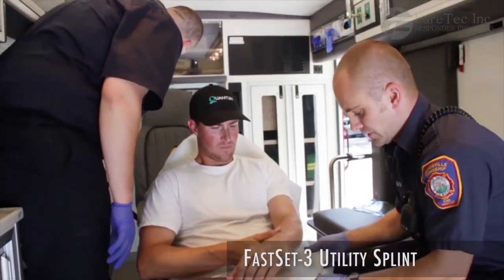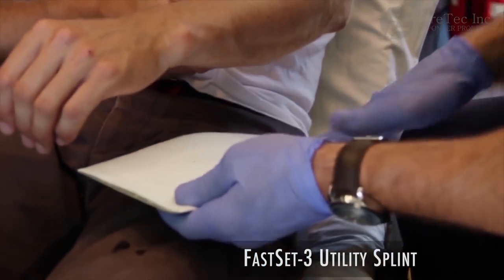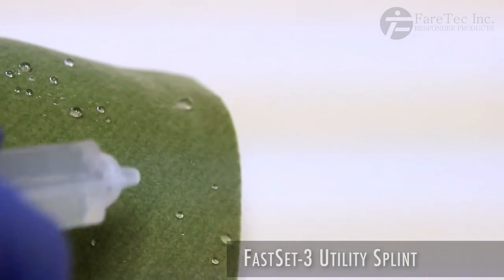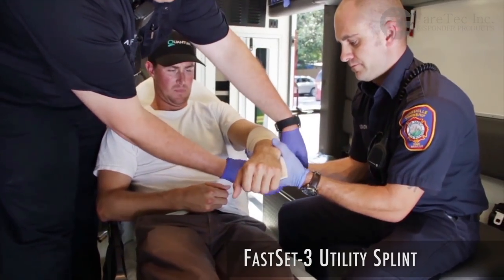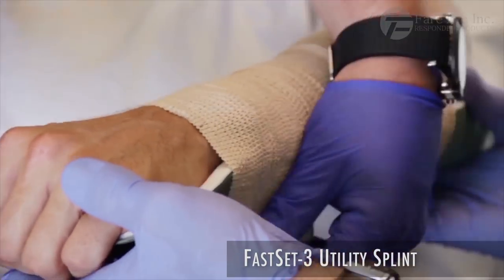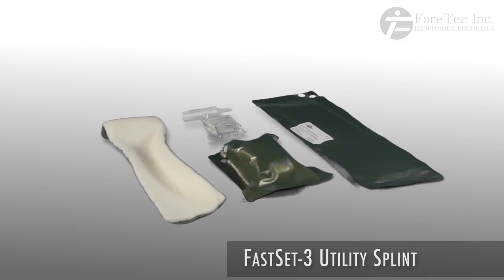The FS3 utilizes a water-activated ortho-glass technology. This fiber is covered with a moisture-wicking polypropylene material that is comfortable for a patient, even during extended transport scenarios. The FS3 is also available as a complete kit that includes an ace wrap and saljet.